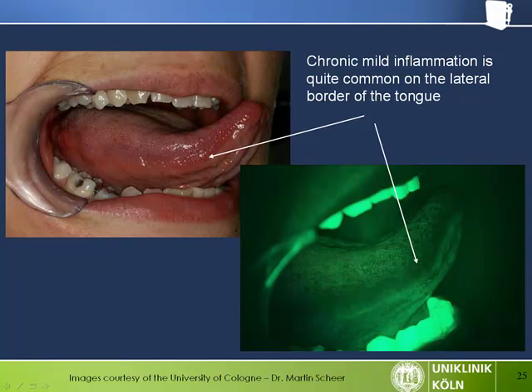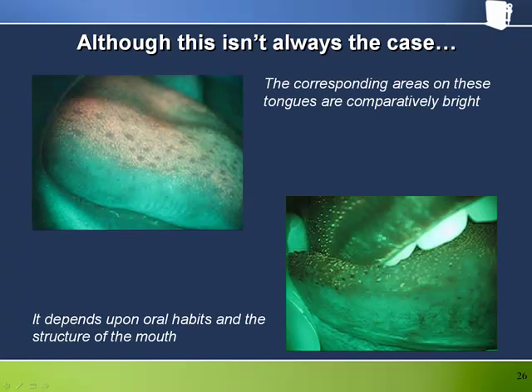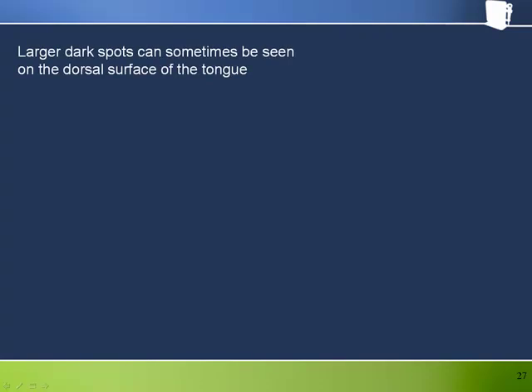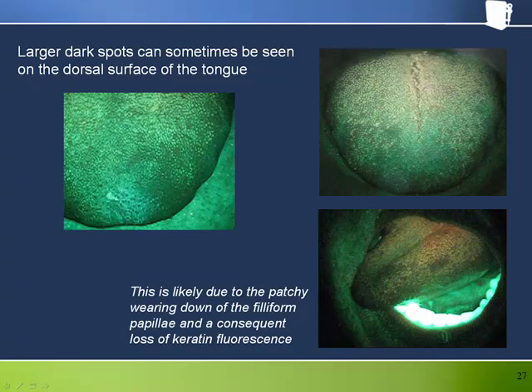The redness along the lateral border is well visualized in white light and corresponds directly with the homogeneous dark band seen through the Velscope. Of course, everybody is different and what we have just seen isn't always the case — the corresponding areas on some tongues are comparatively bright, depending on oral habits and the structure of the mouth. Larger dark spots can sometimes be seen on the dorsal surface of the tongue, likely due to patchy wearing down of the filiform papilla from use, resulting in a dark patch due to loss of keratin fluorescence.